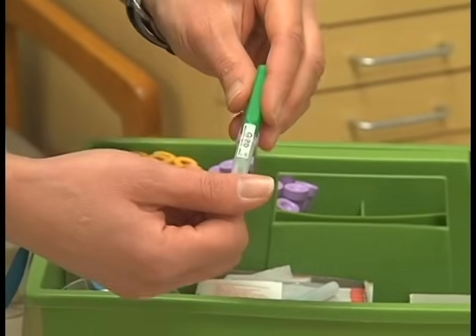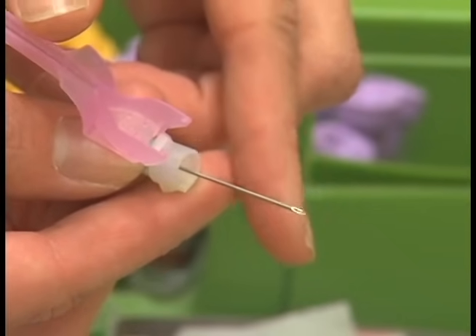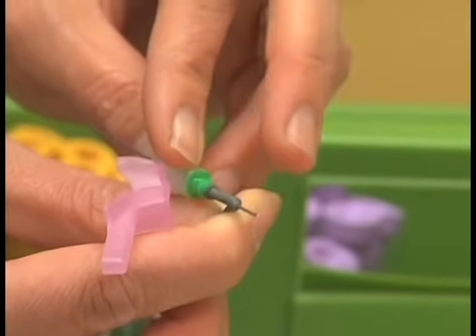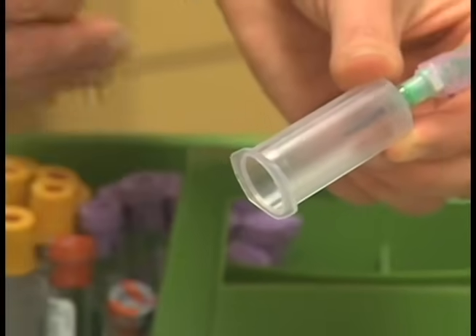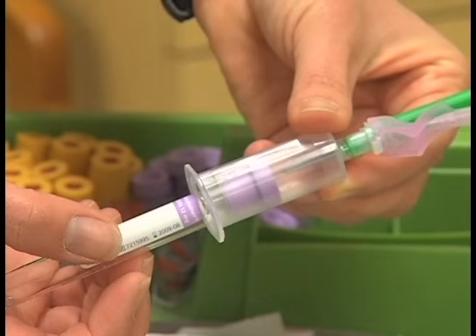Vacutainer needles are packaged in a sealed twist-apart plastic container. The needle consists of a double-pointed stainless steel needle with a threaded hub near its center, coated with silicone enabling it to penetrate the skin smoothly. The anterior needle is longer with a beveled point to facilitate entry into the skin and vein. The posterior needle is shorter and pierces the rubber stopper of the evacuated tube. It has a rubber sleeve that acts as a valve — pushing the tube stopper onto the posterior needle compresses the sleeve, exposing the needle opening and allowing blood to enter the tube. When a tube is removed, the sleeve slides back over the needle opening and stops the flow of blood.